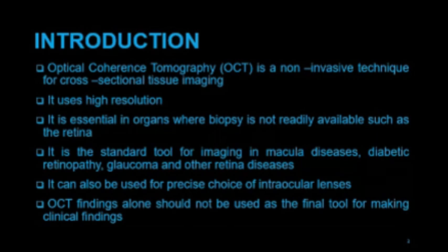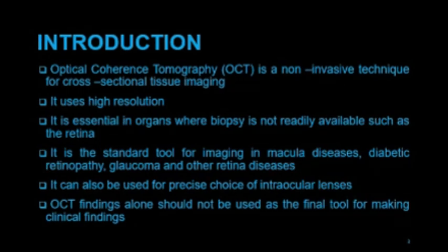It is essential in organs where a biopsy is not readily available, such as the retina. There are organs you cannot just take from your body and go to the lab to examine. So in such cases where you can't do a biopsy, the OCT comes in handy. Are we together? It's also a standard tool for imaging in macular diseases, diabetic retinopathy, glaucoma, and other retinal diseases. So when we are faced with pathological issues affecting the macula, someone who has diabetes, someone who has glaucoma, or retinal issues, the standard tool is OCT.